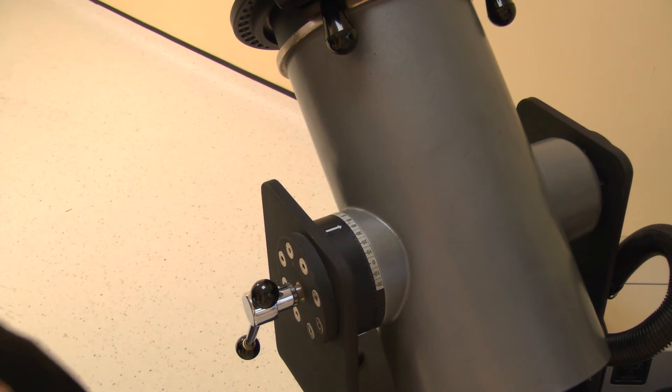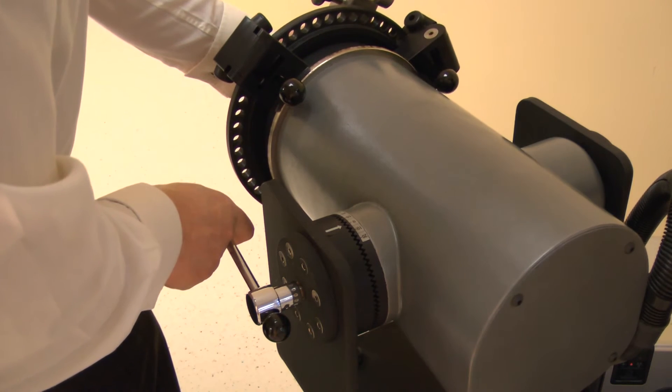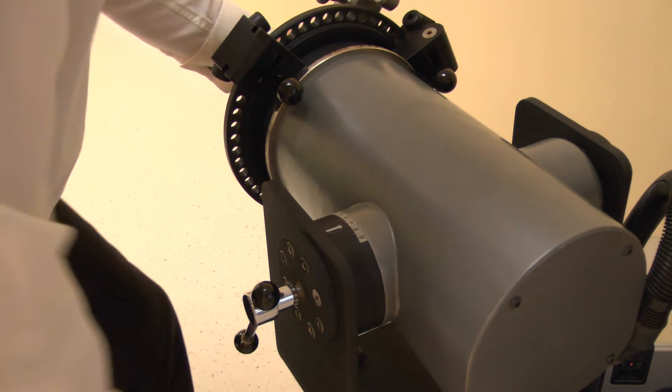Now set the dynamometer tilt. Release the locking handle then change. Adjust the tilt angle to 0 degrees. Lock by tightening the handle.